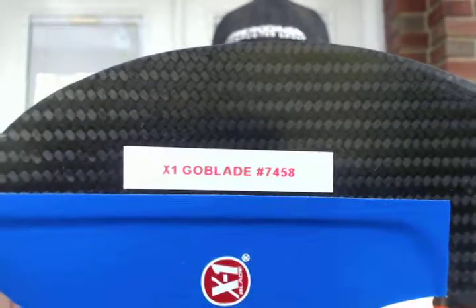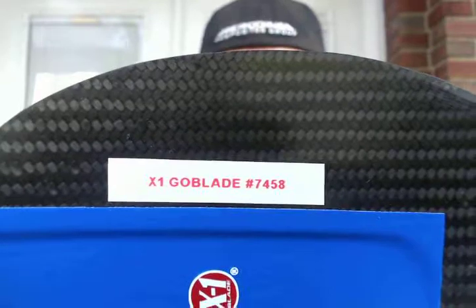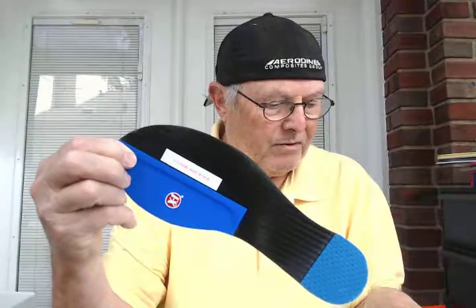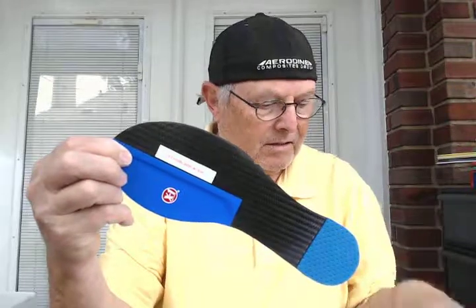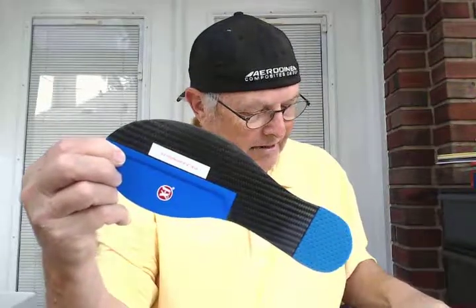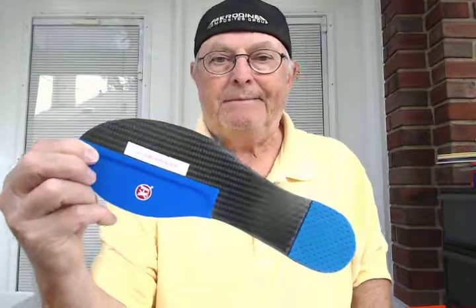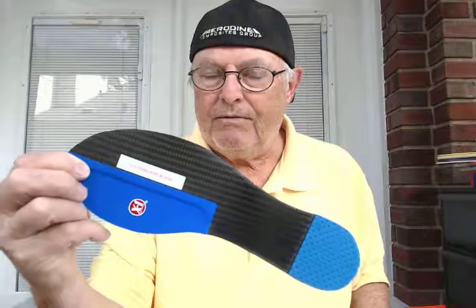Hey guys, Clyde, indianabrace.com. X1 GoBlade, number 7458. It's going out to Mitchell in East Setauket, New York. He's got Hallux Rigidus, had surgery two years ago, not doing very well, trying to avoid the dreaded Great Toe Fusion.